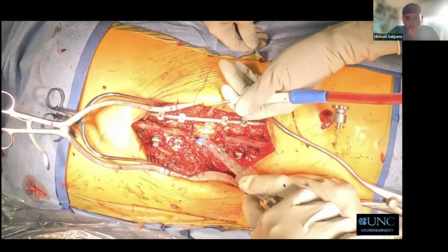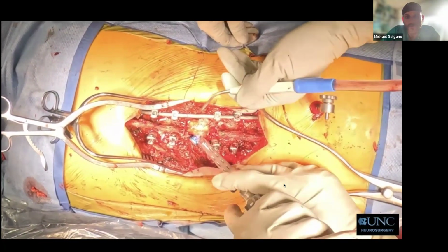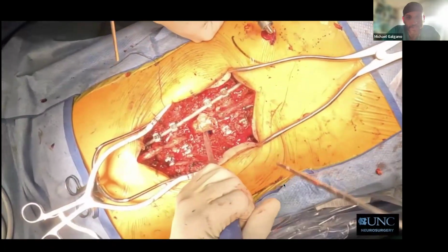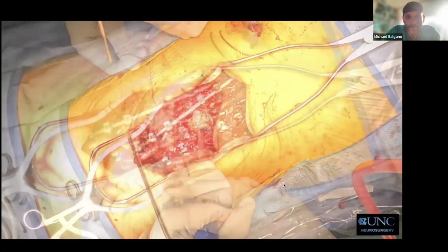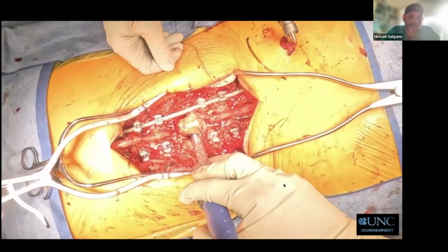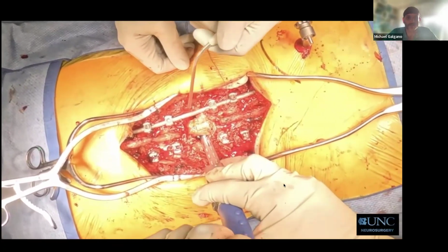And then this is one of those expandable titanium cages. We fill it with bone graft. In this particular case, I don't believe that we cut the nerve root. I think that we had a good enough working corridor here that we were able to put the cage in perpendicular to the spinal cord, and then we performed this 90-degree rotational maneuver.